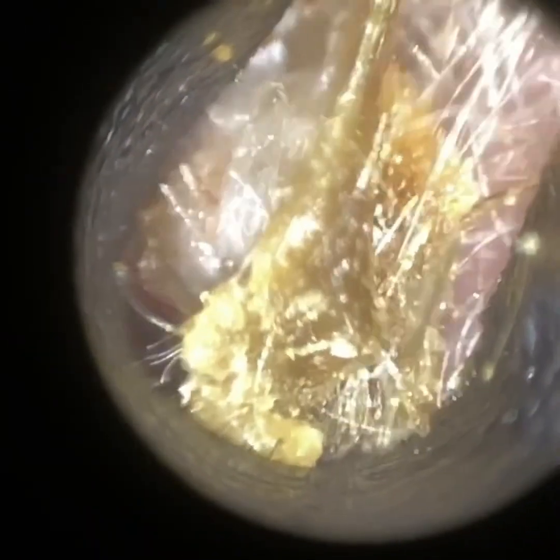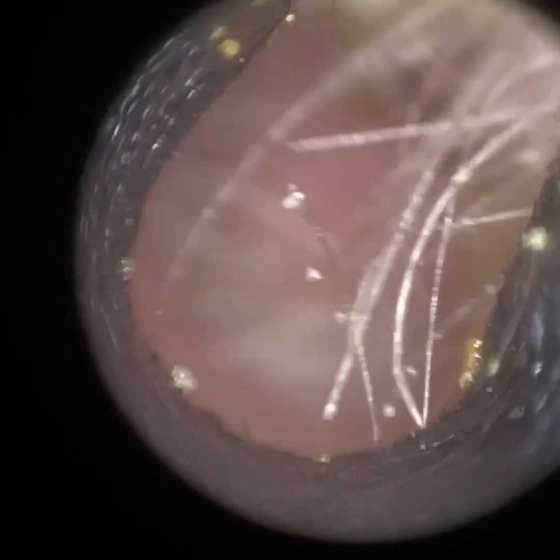Just trying to dilate the ear canal — that's where the specular for the Waxscope really does help. The flagship product is our iClearScope Endoscope, and with an endoscope you would have to dilate and stretch and straighten the ear using the distal end of the endoscope. You would be holding that in your non-dominant hand, whilst your dominant hand would be holding the instrument.